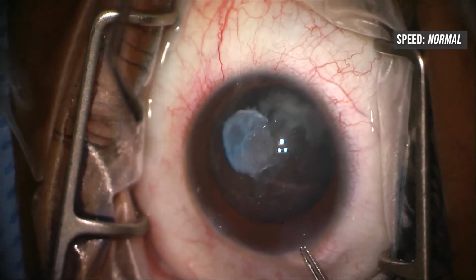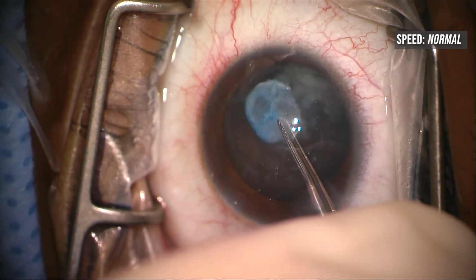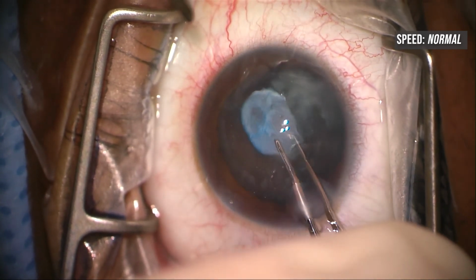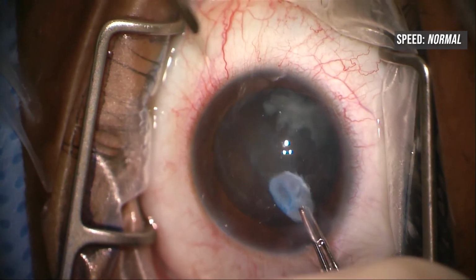Now I'm going to use the Utrata forceps, and I'm still running at normal speed here, and you can see as I pull on it, it's still a little tight. In a second you'll see it pop loose from the underlying lens right up there, and now it's all the way loose.